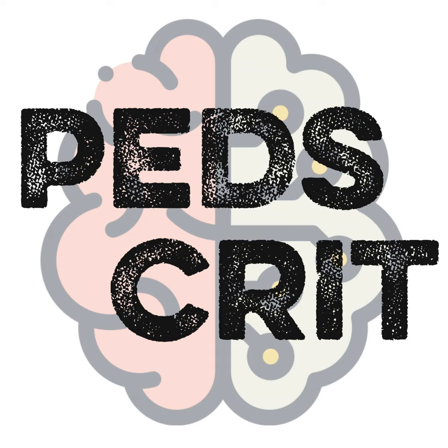The problem is, like everything with ventilators, and I'm not blaming RTs or ventilator companies for this, it's the exact same words for very different phenomena. In volume control with the square flow waveform, people call it a PIP and a plateau. In pressure control, people call it a PIP. And then you have this entire generation of people being weaned on the idea that you can't trust the PIP. But in this other mode of ventilation, the exact same thing called the PIP, you very much can trust. So that's annoying, but that's all that is. Annoying, right? Yeah. Super annoying.